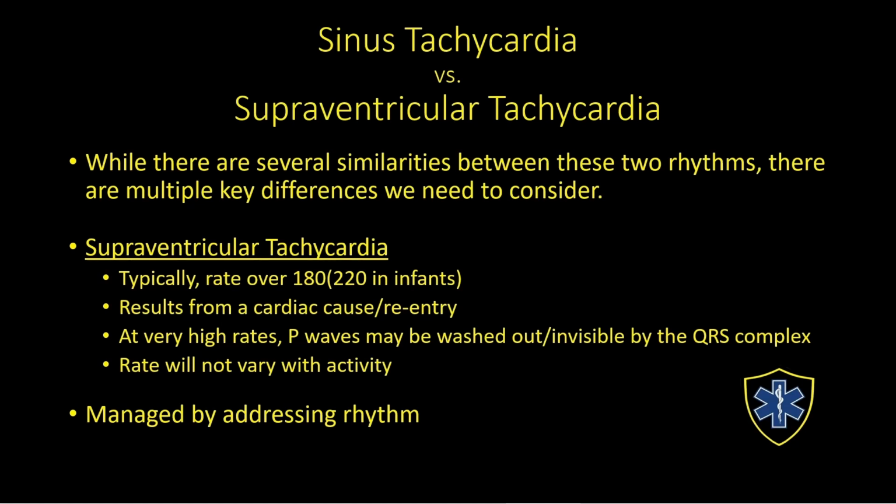Paroxysmal supraventricular tachycardia is SVT that comes and goes, as the paroxysms of it. It starts on its own and it ends on its own. This can be very, very difficult for providers to identify. The reason is the patient will experience a run of SVT and they're having symptoms, maybe fluttering or tightness in their chest, maybe poor perfusion, near syncopal episode, lightheadedness, dizziness, all sorts of signs and symptoms.